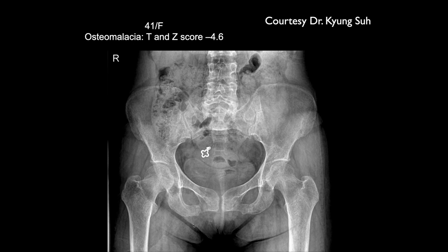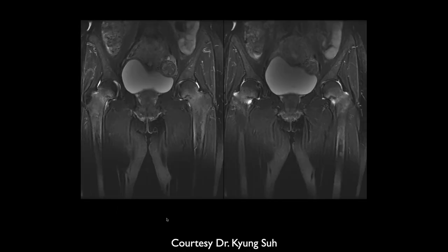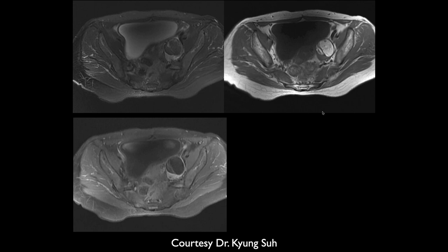Femoral neck on the right looks a little bit irregular. I don't know if I can follow the trabecular lines there. Very clearly here, there's marrow edema bilaterally, and there's irregularities through both femoral head neck junctions, subcapital, incomplete fractures here.